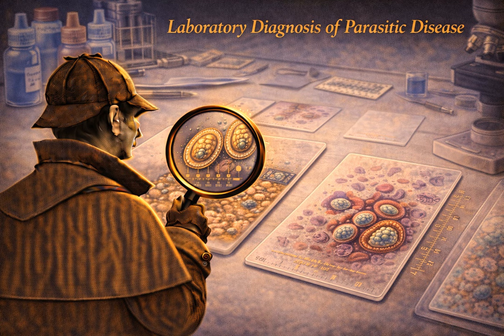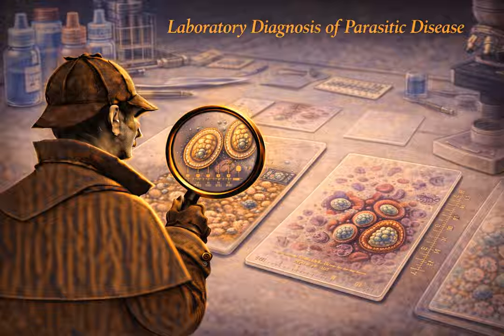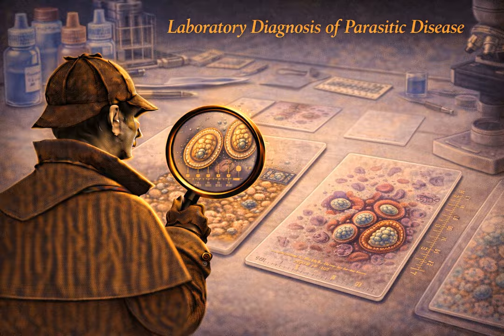That is fascinating. What about the actual form of the parasite? Because I feel like that trips people up constantly. We are so used to looking for the bug, but these bugs literally change shape. It is a massive stumbling block. Let's look at Strongyloides stercoralis. This is a very important intestinal nematode. Now, for almost every other intestinal worm, like Ascaris, which is the giant roundworm, or hookworm or whipworm, we are trained to look for eggs in the stool. Right.